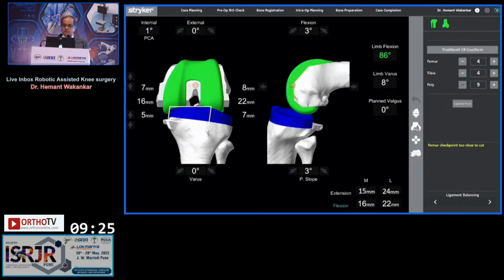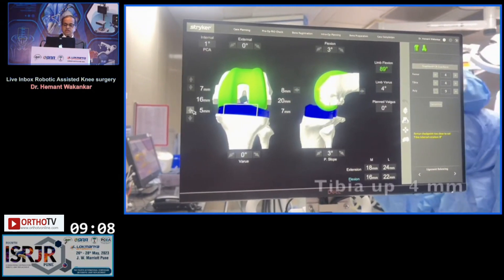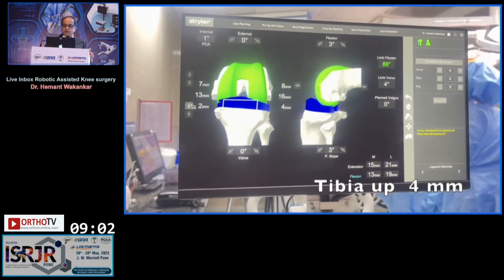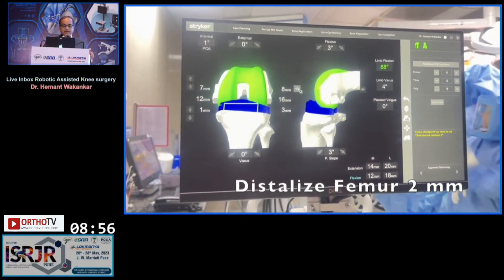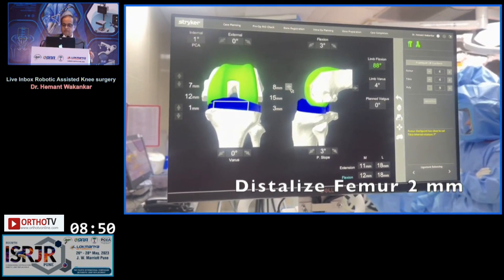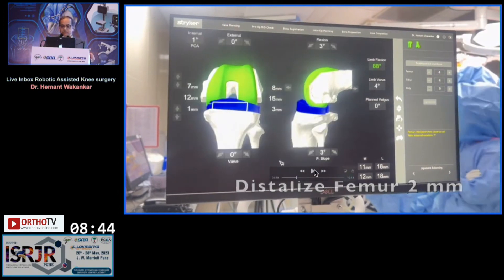Next comes virtual balancing. At this point we have the implant positioning already set. I will get the tibia up four millimeters, and you can see the tibia going up and the lateral gaps are reducing. Then I get to 18 millimeters in flexion — so that is where I stop. The extension gap laterally is still 20 millimeters, so I distalize my femur by 2 millimeters. When I do that, I get my lateral side to 18 millimeters.